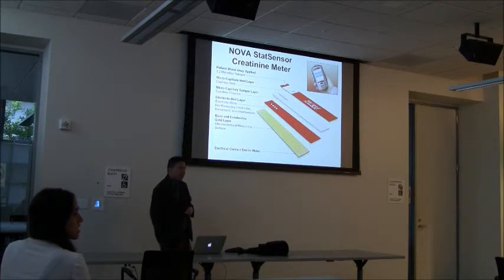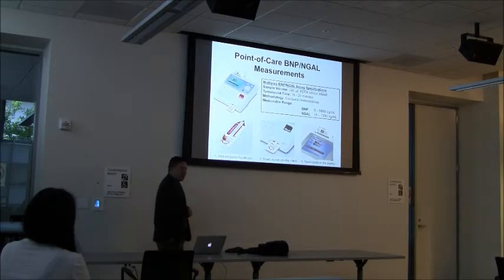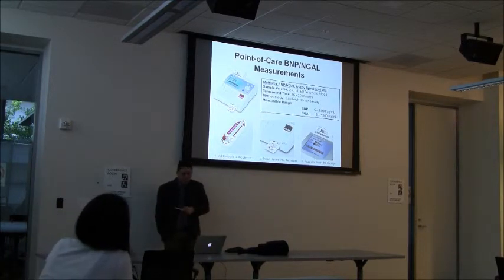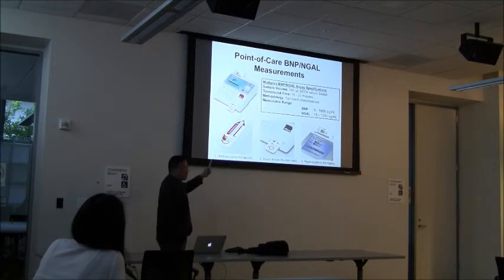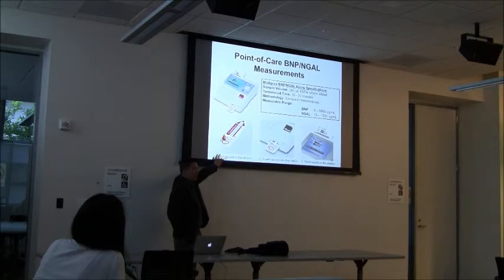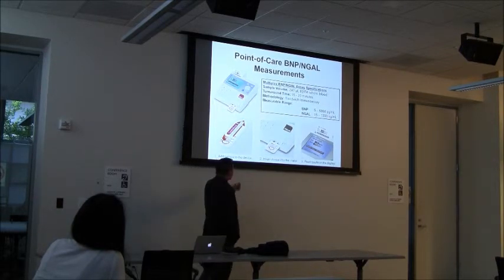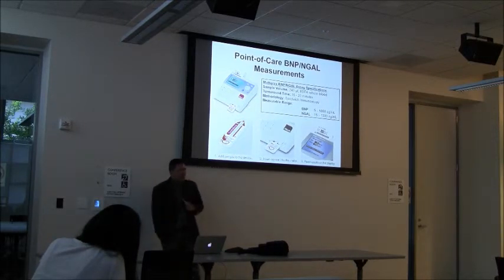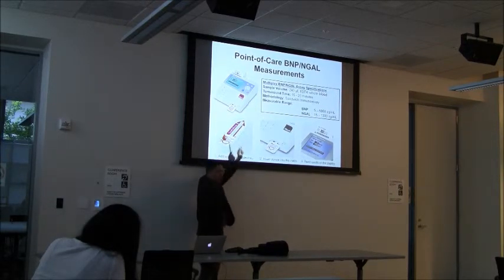Other questions? Okay, so why is the other device not FDA approved? This one? Yeah. So this one is because they chose not to. And the reason is, if you go back to the history of this company, they came up with a sepsis biomarker assay that included NGAL and 2 other biomarkers. It failed miserably and didn't detect sepsis well. And so they decided to move on and try to continue to market some of these biomarkers. A lot of the NGAL research actually came from Europe too, and most devices really go through the European pathway first. From what I've discussed with them, they're still not happy with the performance of this NGAL assay to the point where they want to submit to FDA, and they're going to rework it. In fact, I think they're even redesigning this whole test card as we speak.